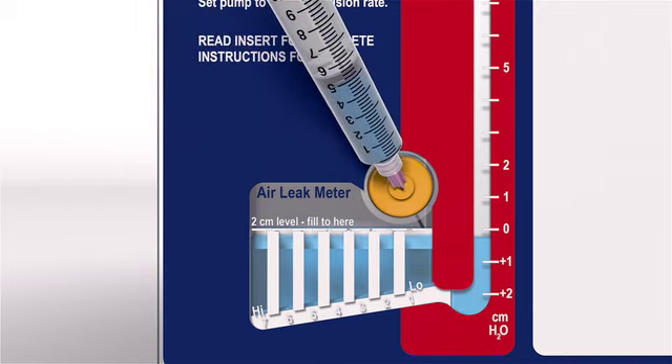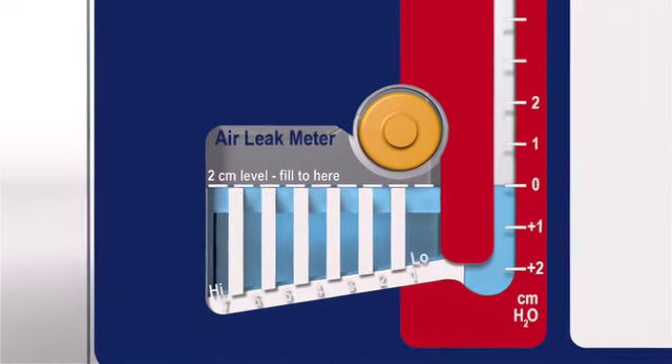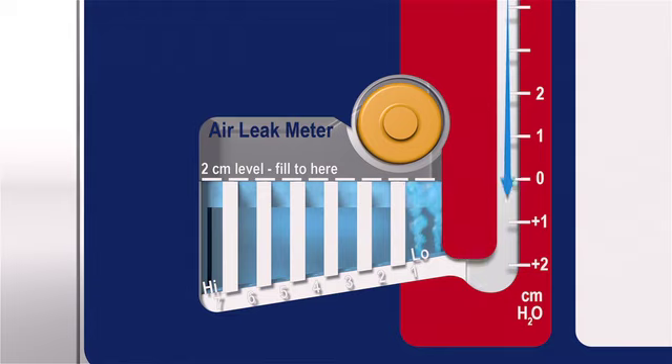Angle the needle downward. If the patient has an air leak, bubbling will appear intermittently with respiration in the patented patient air leak meter. Note the column farthest to the left, in which a series of bubbles appears. By observing the furthest bubbling column and notating changes over time, it can be determined whether the air leak is increasing, decreasing, or staying constant.